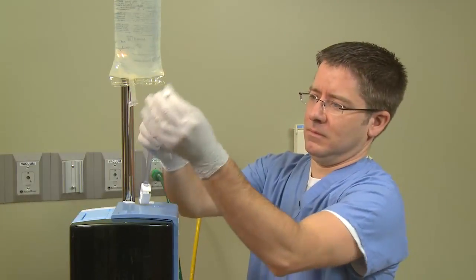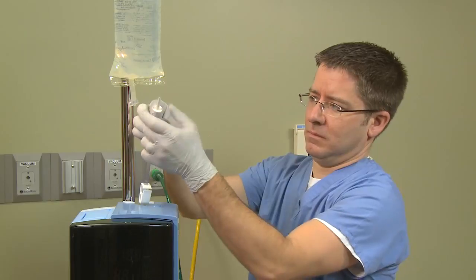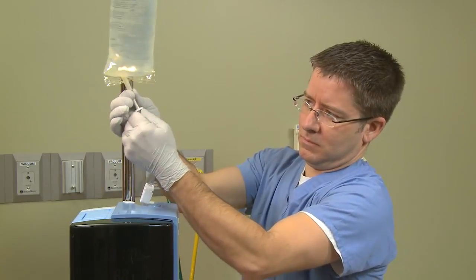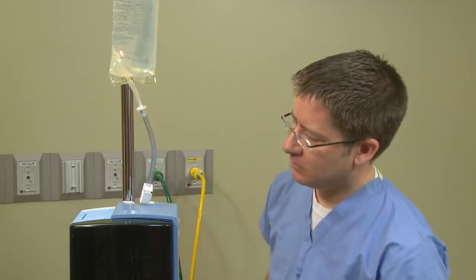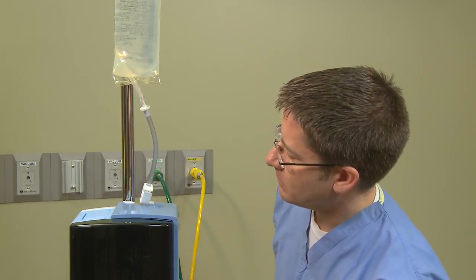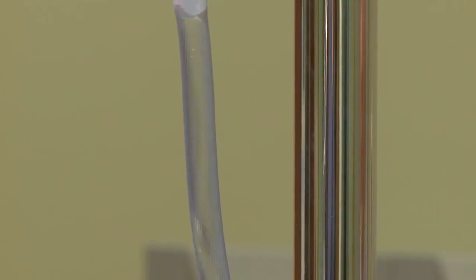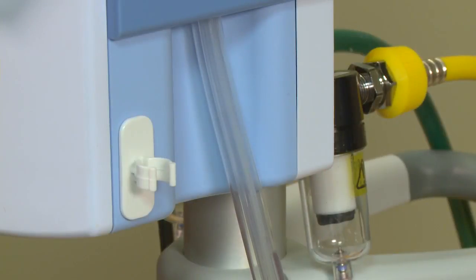Using aseptic technique, take an alcohol wipe, rub the tip of the water spike, and then spike the water bag. This is very important: before turning on the unit, unclamp the spike adapter and let water fill the entire disposable patient circuit — approximately 200 milliliters of water. Visualize water falling into the disposable and starting to fill the delivery tube. This will take about 60 to 90 seconds.